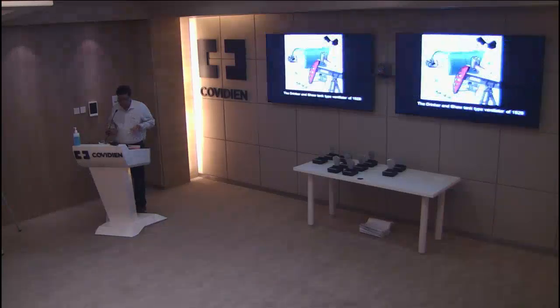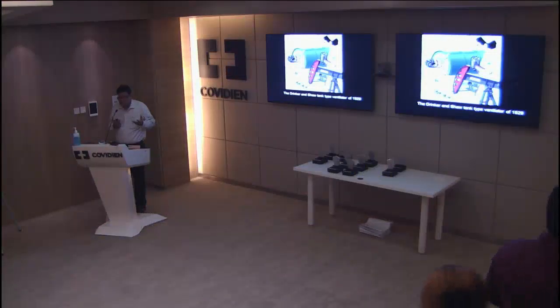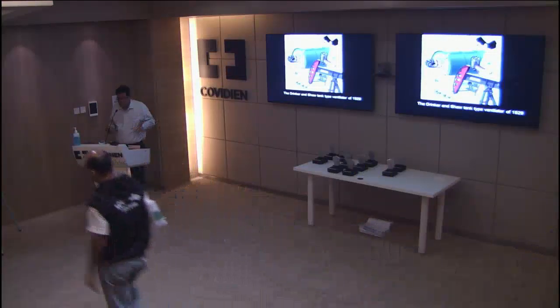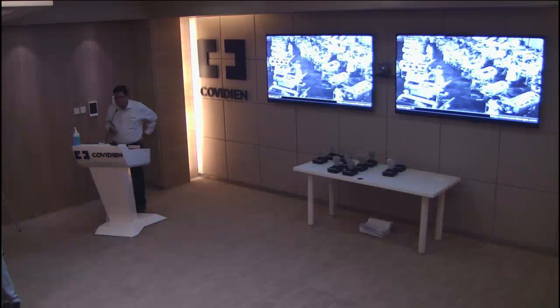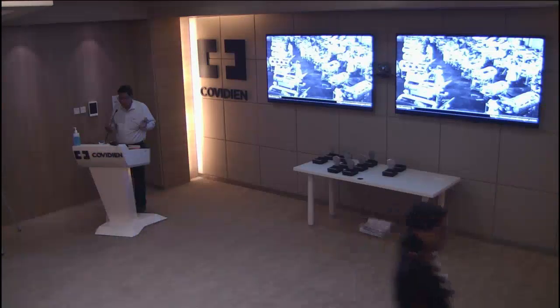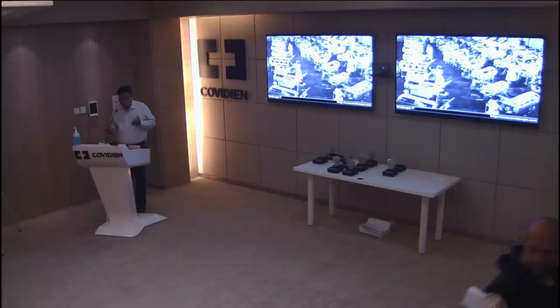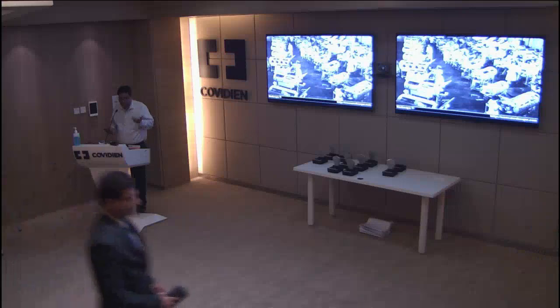Initially, we had negative pressure ventilators, the so-called iron lungs, where a negative pressure was created around the chest and air moved. Those were the original ventilators. But there was an epidemic of polio in Scandinavia in the 50s, and they virtually ran out of iron lungs because they were overwhelmed. There was a major epidemic of polio in the 1950s, and that is when positive pressure ventilation took over.